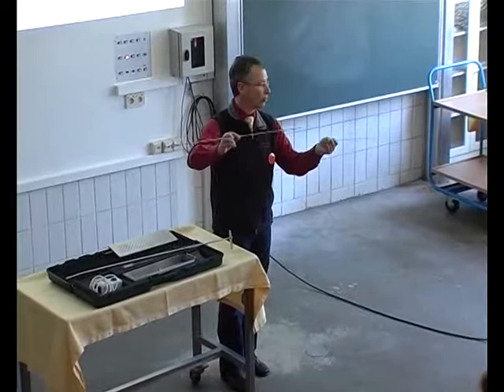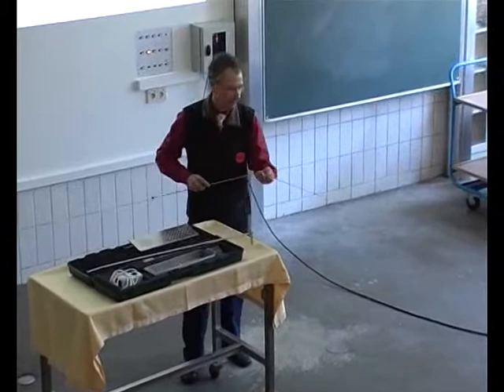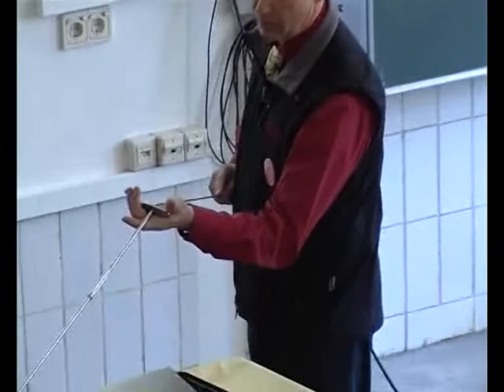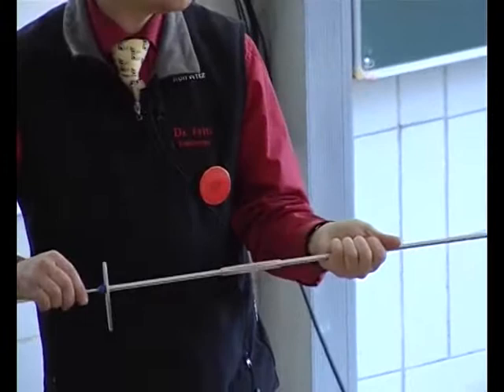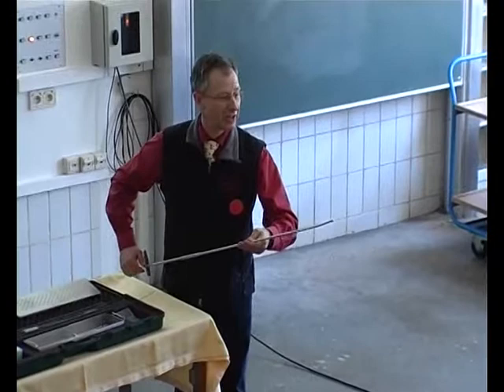1 inner tube with the lancet, and the lancet fits automatically into the disinfection or autoclaving box, and it can be replaced as a single part if the lancet tip is not sharp enough anymore. Please be aware when you pass it through, the edge of the eye of the neighbor is in danger because the tip of the lancet is very sharp.